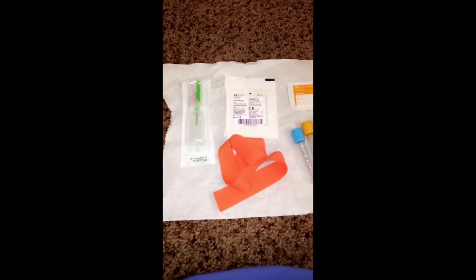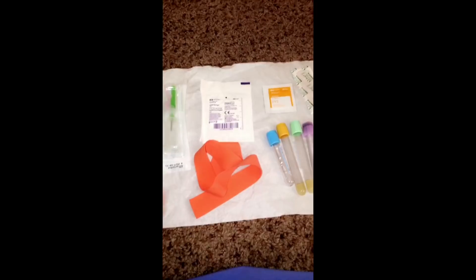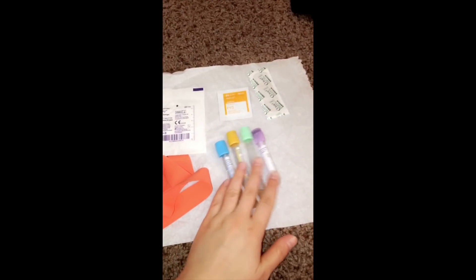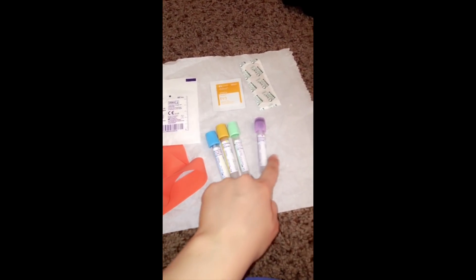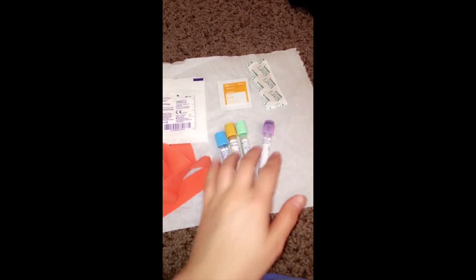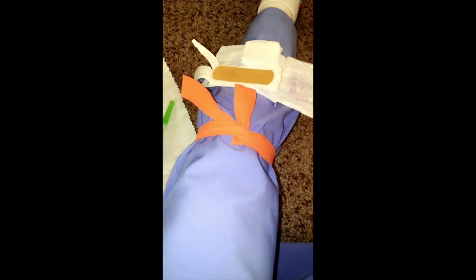So I'll show you guys how I set up when I have to do a draw on a patient. This is exactly what it looks like — I grab a napkin from their room, I put it on their lap, I put all my stuff on top of it. I put my tubes in the order of draw. You guys remember the mnemonic? Bring your good veins: blue, yellow, green, violet. Then I put the tourniquet on and then I put the band-aid and the gauze kind of on their shoulder so I can easily reach it. And because I'm right-handed, I put the rest of my supplies on my left side. I took the vacutainer out of its packaging and put my first tube already in it.